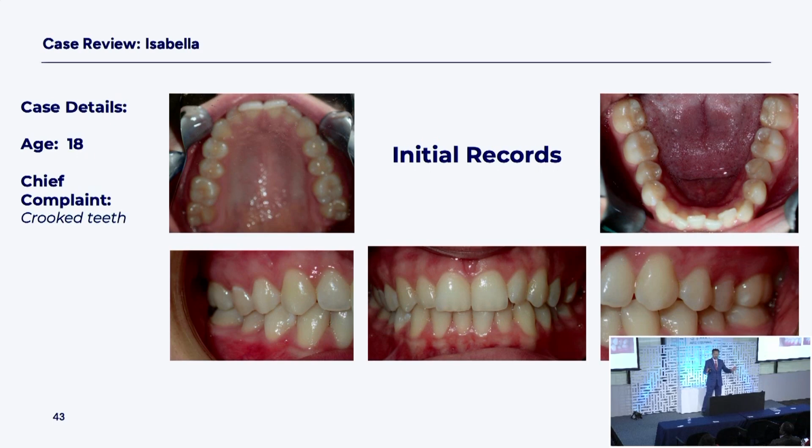No IPR, no attachments. But I'm going to give you a little bit of a hint about the upper laterals. It turns out more than 50% of the time the upper laterals are not a proper tooth size. So you have a discrepancy in the tooth size at the lateral more than half of the time. That translates into, if we don't have an IPR technique going on here, and we don't, and we want to unravel all the teeth, more than half of the time I should end up with space at my upper laterals. That's what that means.